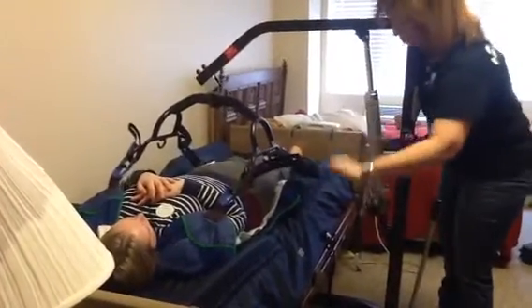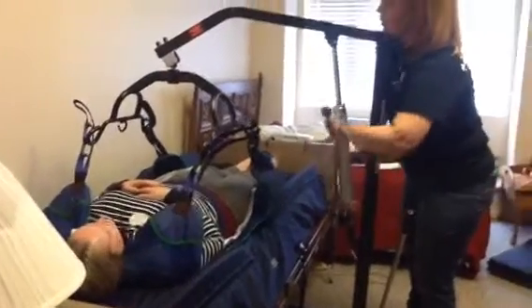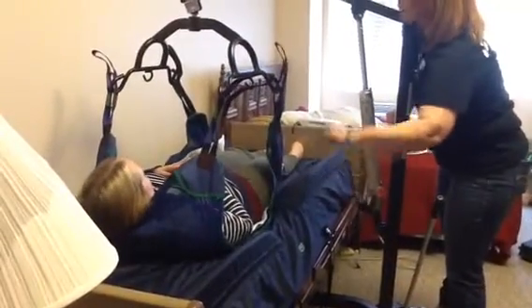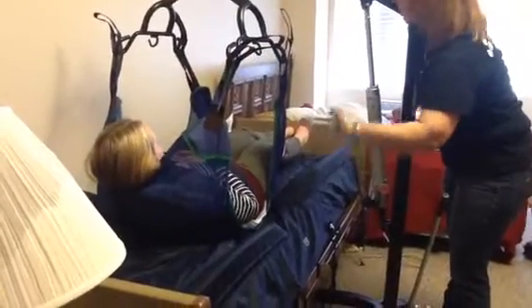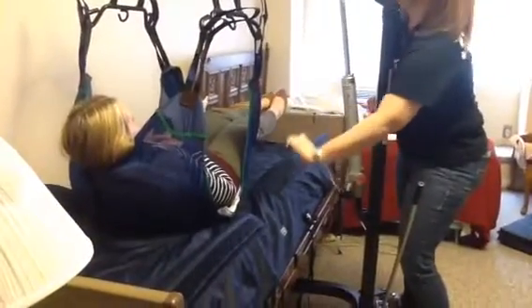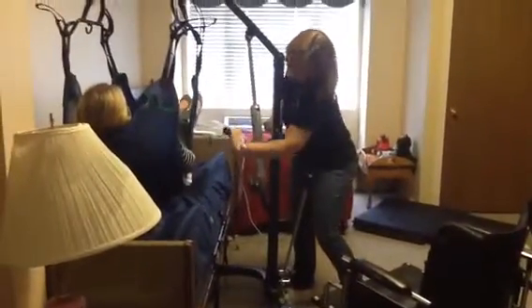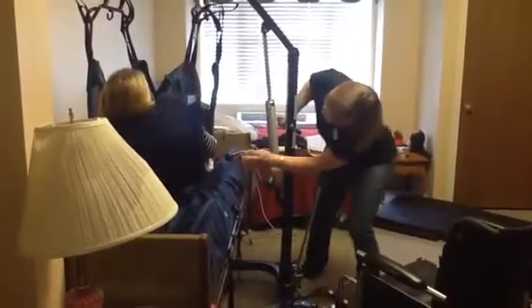Like I said, this is a manual one. Takes a little bit. You just got to pump it up. And even as you're going and you start lifting your resident up, keep asking them, you doing okay? Yes. Okay. Everything all right? If they start getting a little nervous, just reassure them everything's okay. Keep checking to make sure you've almost cleared the bed. Like I said, you don't need to take them to the ceiling. They don't need to fly that high. And it looks like we've cleared the bed and we'll have enough room to get her into the chair.